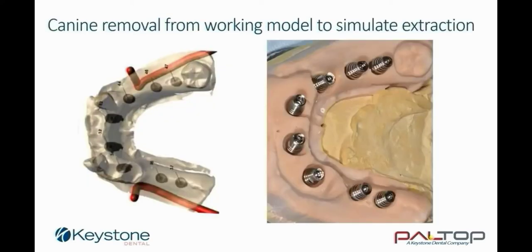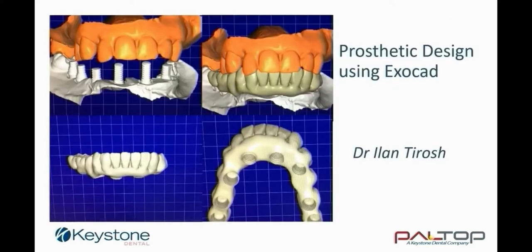The 3D printed model was delivered. The canines were extracted from the model. Multi-units were connected to the DIM analogs, and temporary titanium sleeves were screwed onto the multi-units. Dr. Tirosh was now able to scan the multi-unit abutment sleeves, together with the working model in the opposing arch, and to design a hybrid screw-retained bridge. This was done using ExoCAD.